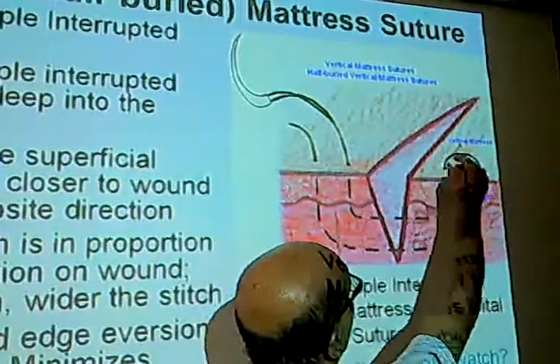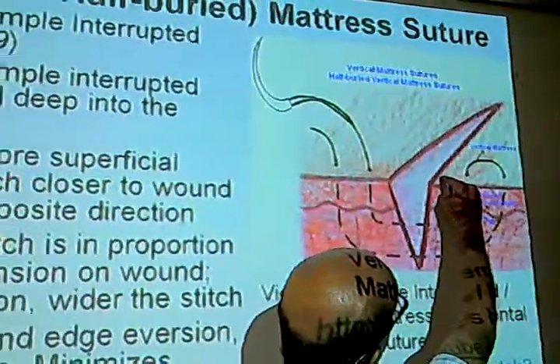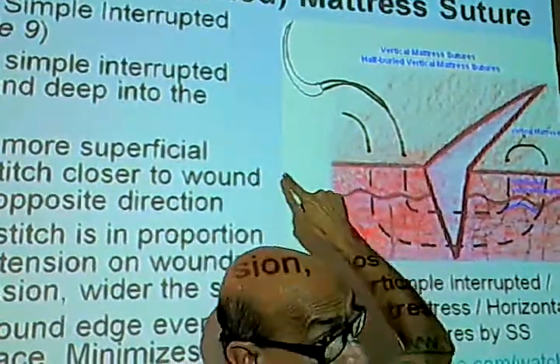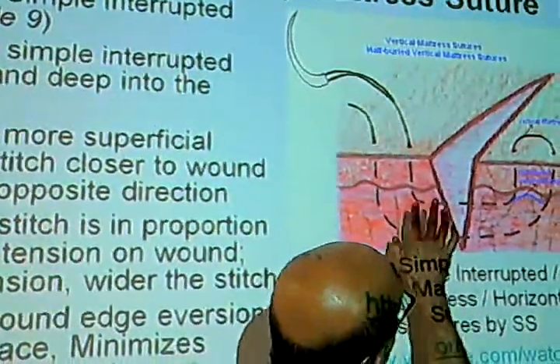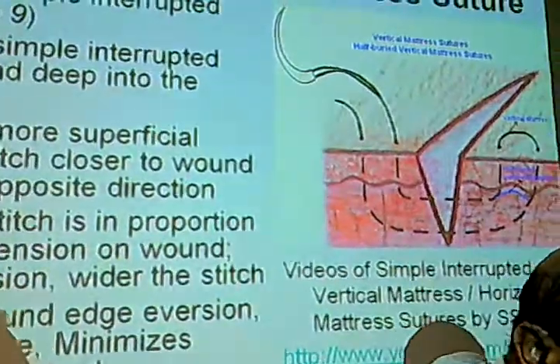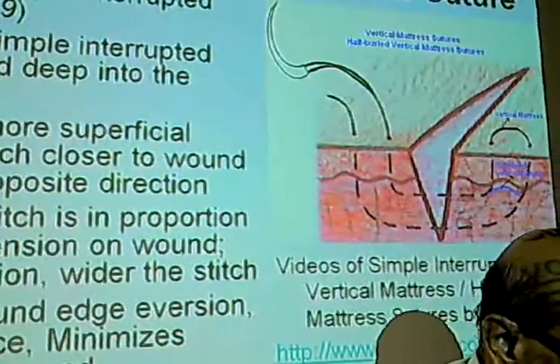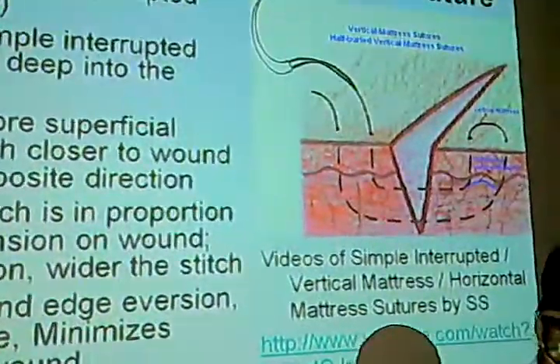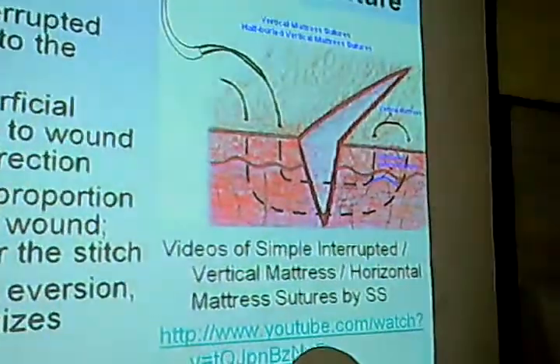And the next one, he has shown it very far away. It should have been closer here, dermoepidermal junction. Dermoepidermal junction, and we tied it off here. So this and this are in the same vertical plane. Did you understand? That was the reason we call it the vertical mattress. Some of you went a little this way, that way, but you'll get used to the technique.